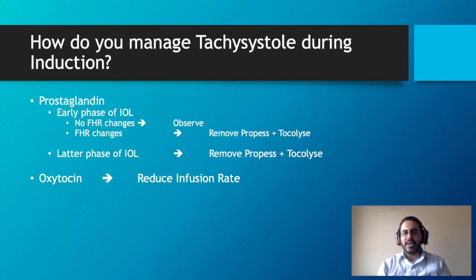So remember, I'm talking about tachysystole. The baby is not responding as yet, the baby is not even feeling them as yet, but I now have 6 in 10 contractions. Does that make sense?